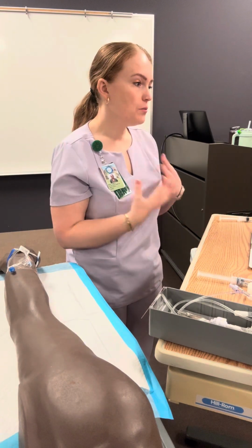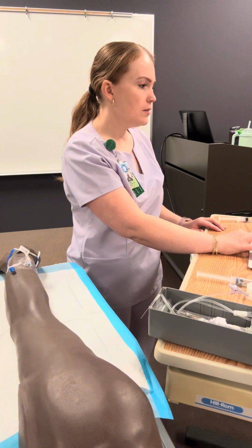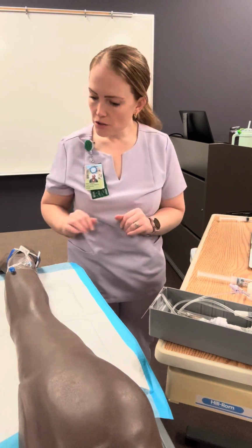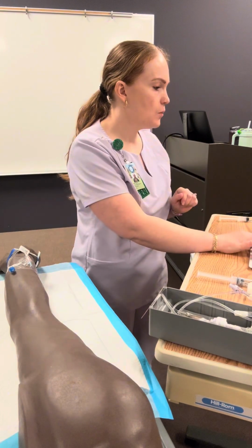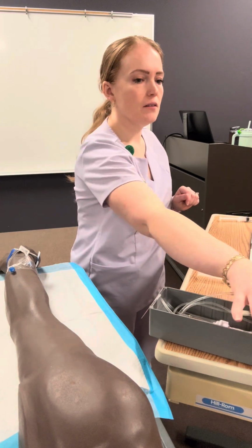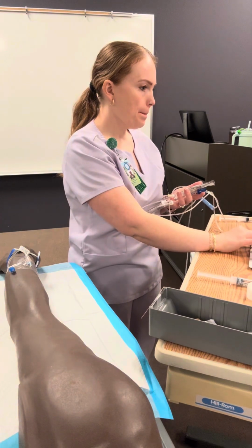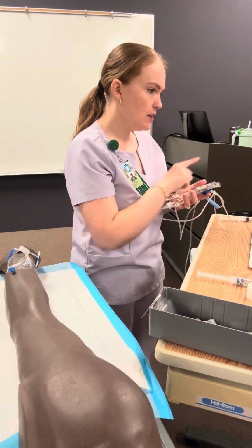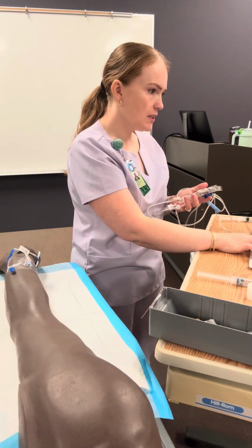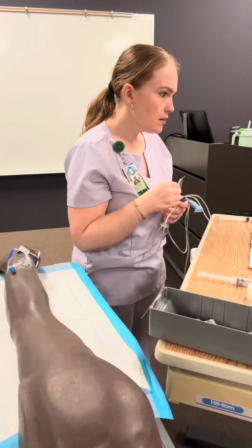So I'm going to move on to my MedCheck 3. I'm going to move back over to the MAR. And this time, I'm going to look at your wristband, Miss Code Brown 61851. The medication we have here is sodium chloride, the right patient, the right drug. Sodium chloride. The right dose is 50 milliliters. The right route is an IV. The right time is to be given at 7:14. It is 7:14. And we are good to go.